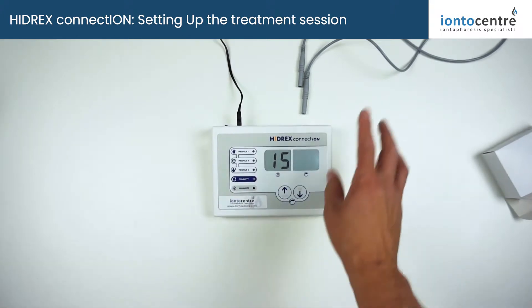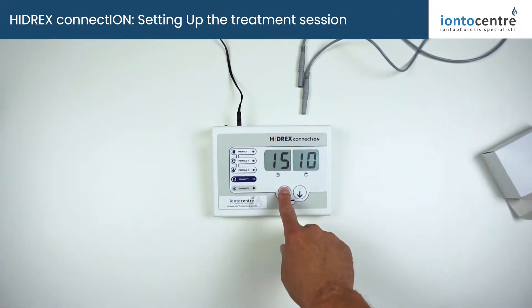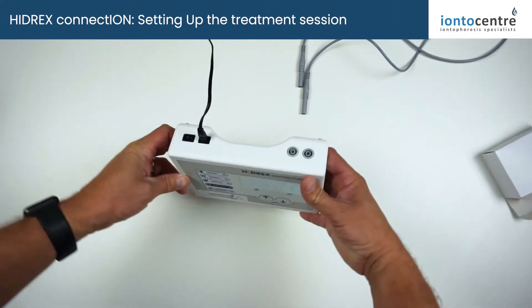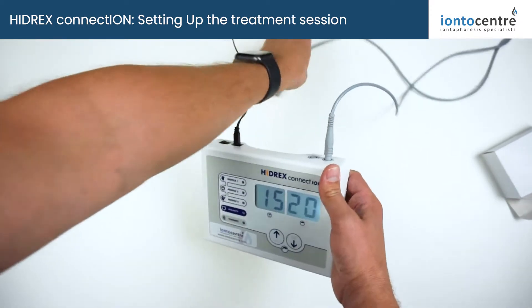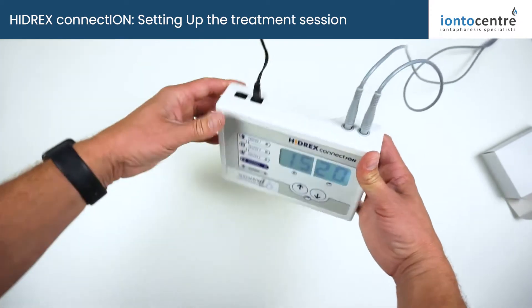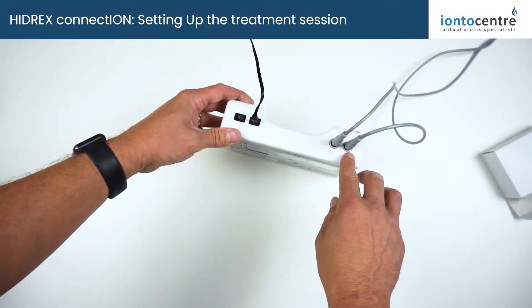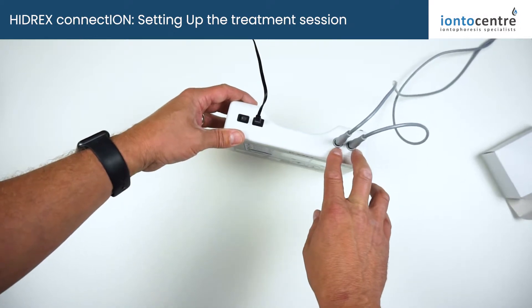So here we are — we've got 15 minutes on the timer and 6 volts on the power at the moment. I'm going to increase that to 20 for your first treatment. There are two ports on the back of the machine where you insert your electrode cables. These aren't marked positive and negative, but one side is your positive and the other is your negative — this is described on page 9 of the instruction manual.